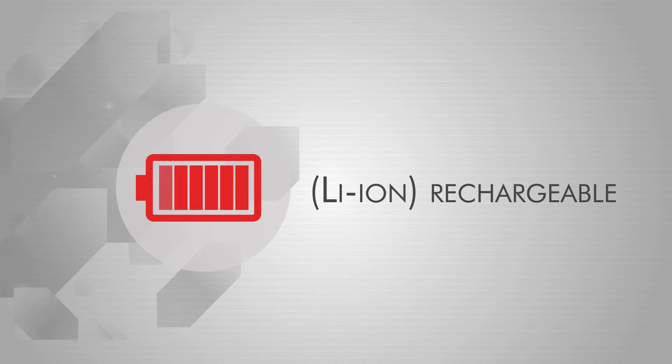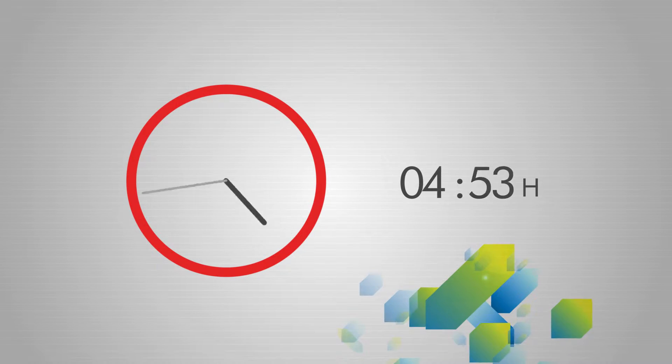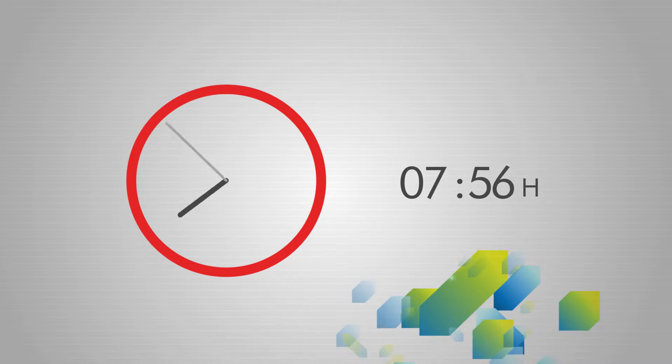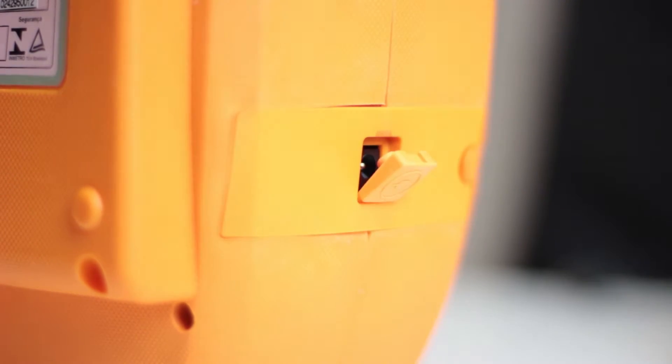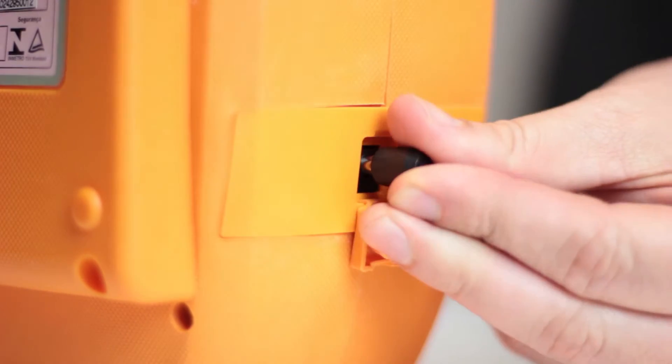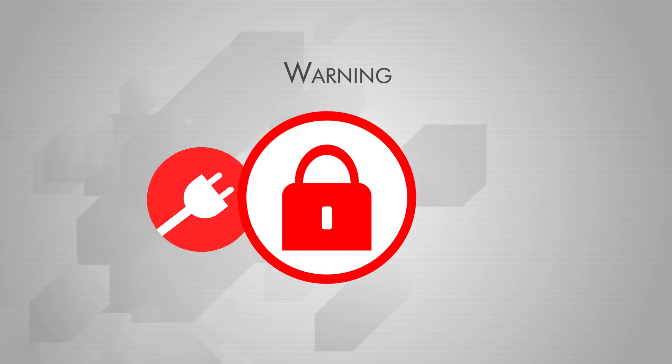The eSys batteries are rechargeable. Before using this device for the first time, the battery must be charged to full for at least eight hours. To charge, connect the charger to the port on the side of the device and then to a power source. Warning: this device cannot be operated while connected to a power source.